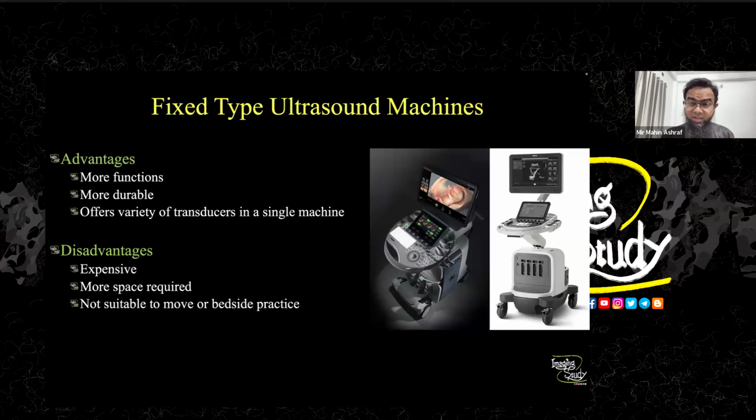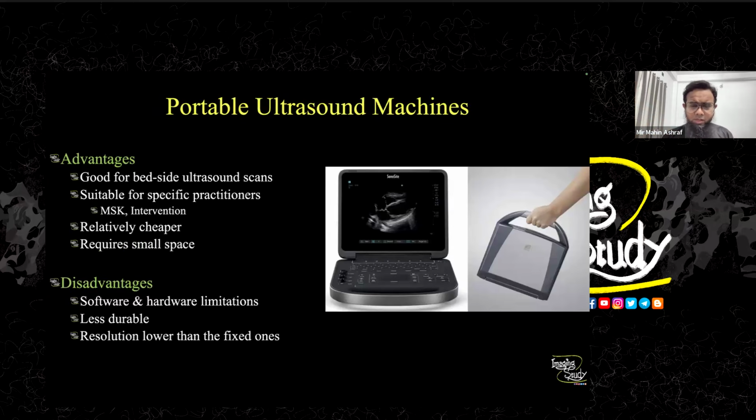So if you are trying to take this machine to a different area, like even if you are on the first floor and you are trying to go to the second floor, moving these machines is a little bit difficult because there are so many cables and it needs a very big space. So it's not suitable for bedside ultrasound practice or portable ultrasound tests.